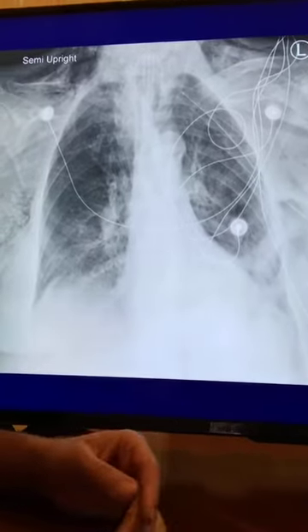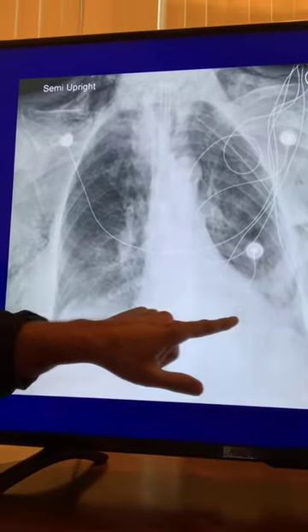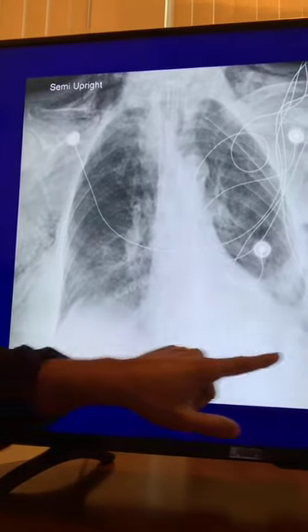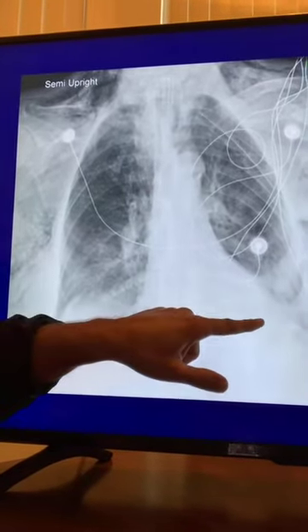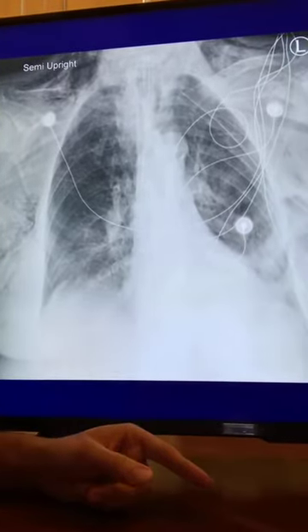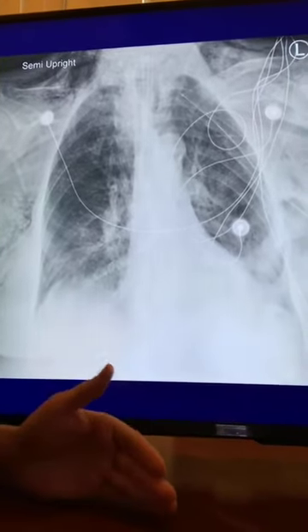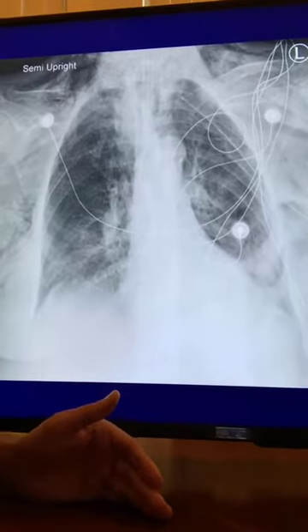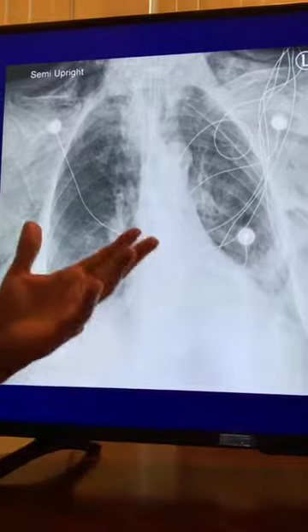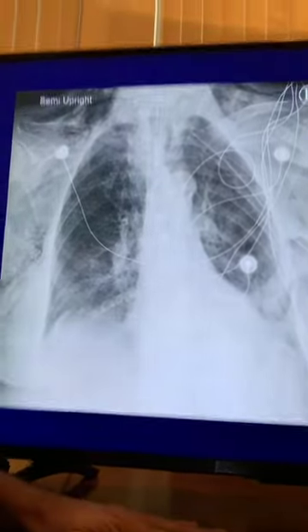All right, going back to some other live that we did before. Remember, what is a continuous diaphragm sign? Because remember, your hemidiaphragm should stop right here. Your other hemidiaphragm should stop right here. You should never see it cross over like that. If you do see it cross over like that, you need to be concerned that there's some sort of abnormal gas somewhere where there should not be, all right? You need to be concerned about pneumoperitoneum. You need to be concerned about pneumomediastinum, something. Any sort of abnormal gas will give you a continuous diaphragm sign, all right?